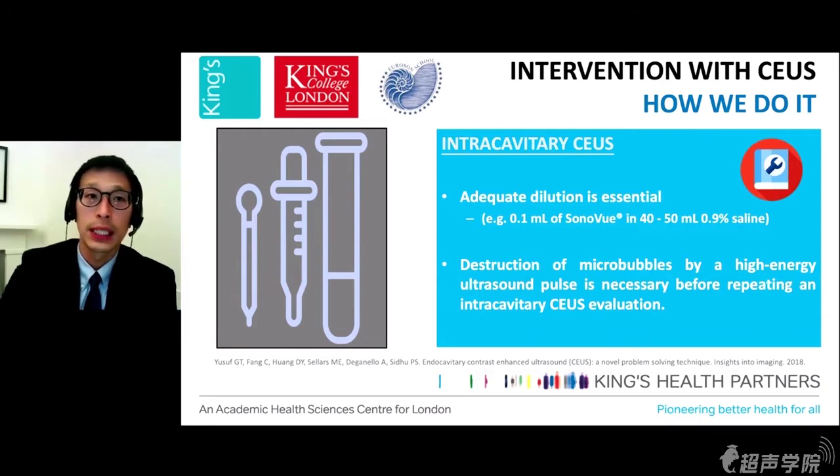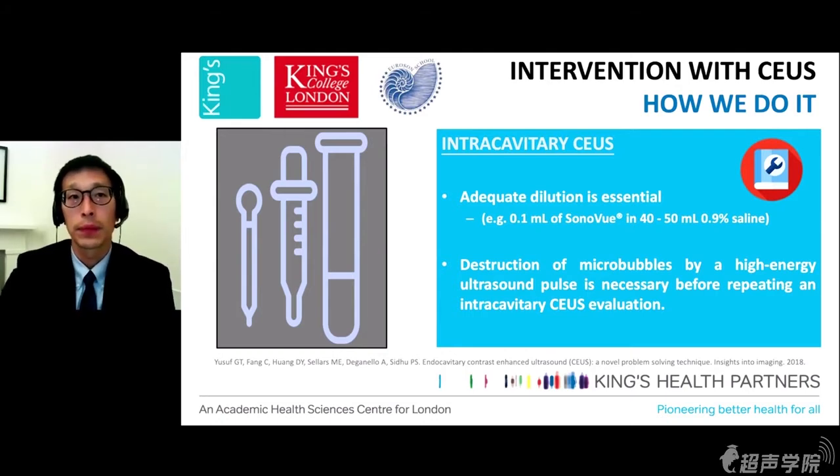And if you want to repeat an examination, it's important to remember to destruct and burst all these bubbles with a high energy ultrasound pulse. For example, if you want to look at a bladder with contrast, you want to make sure you have destroyed all these bubbles that are already in the bladder before you repeat the examination again.